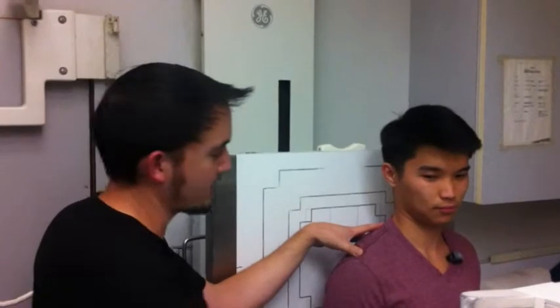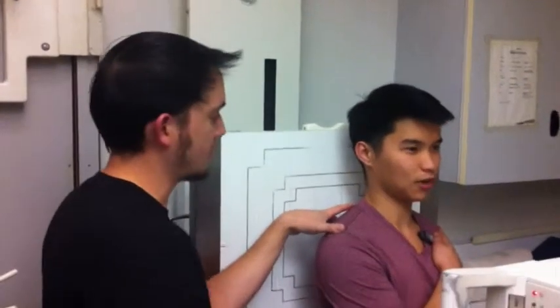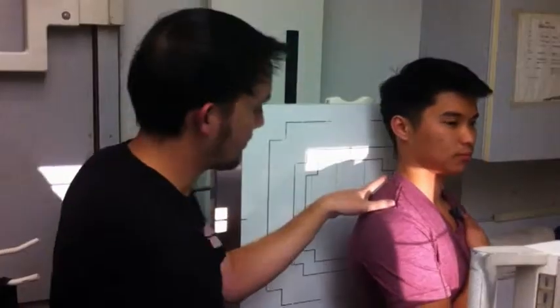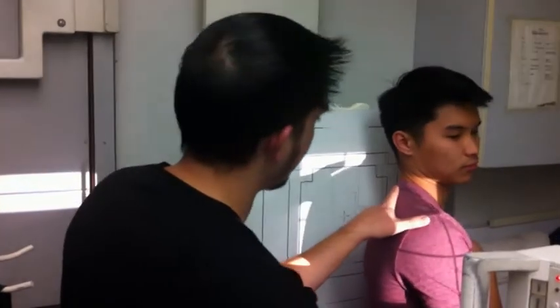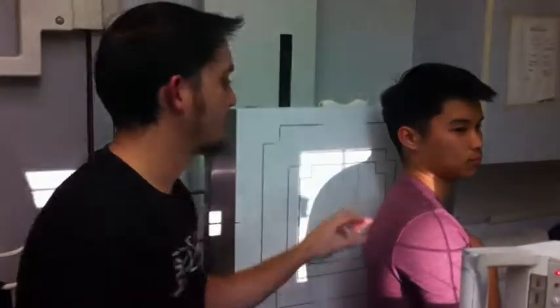We want to have the patient do like a Star Trek Enterprise position, right arm over his shoulder. This imaginary line will go perpendicular with the bucky here. So go ahead and move that way. So it's perpendicular. There you go.